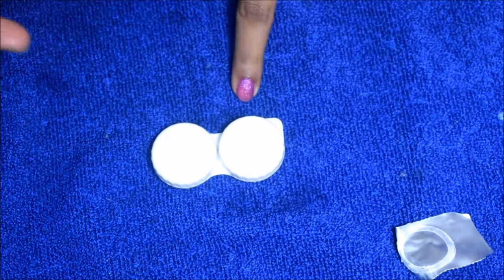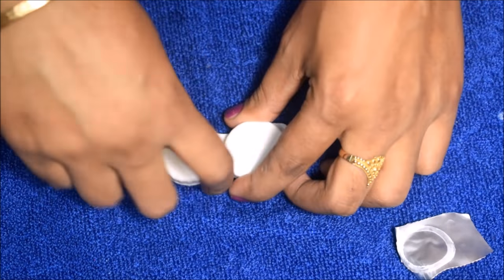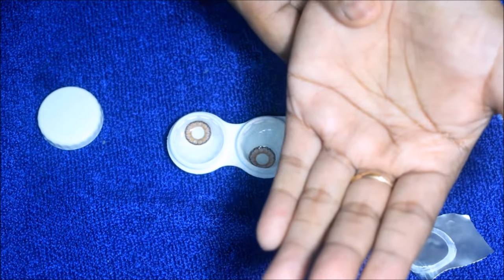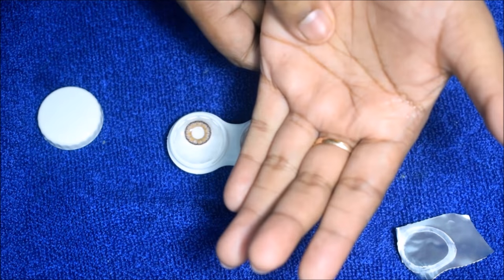You can store it. Next time, remove the lens with the solution. When you remove the lens with the solution, you can then handle the lens with your hand.